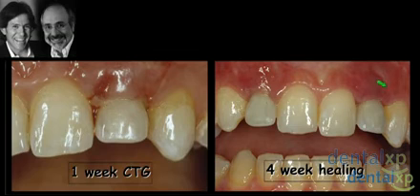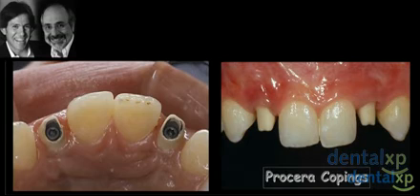You can see here this was done with autogenous tissue, but again, able to build out the contours of the ridge utilizing tissue taken from the tuberosity, thicker, denser, more fibrotic tissue, something that you actually taught me when I first came to the office here in Atlanta some 18 years ago. Long time. In this case, how about doing a vertical tunnel? Have you done that?